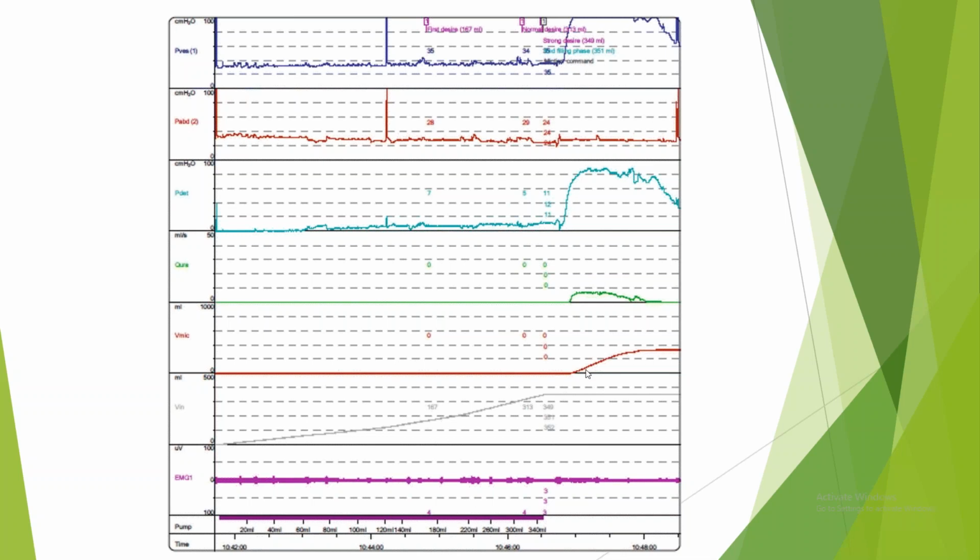But this can be reduced bladder capacity also, or it can be high PVR also. So actually, we can't tell the causes from here, but we can tell it is a reduced bladder capacity along with a voiding dysfunction. It might be obstruction or a hypercontractile bladder.